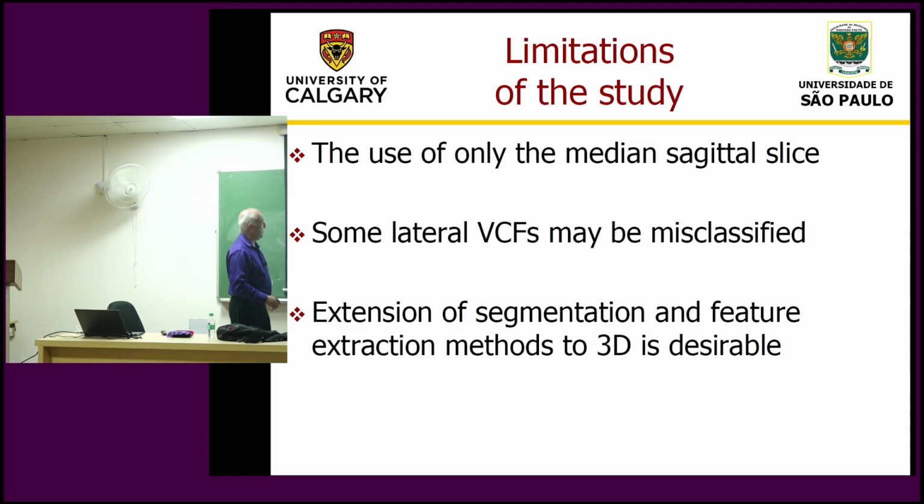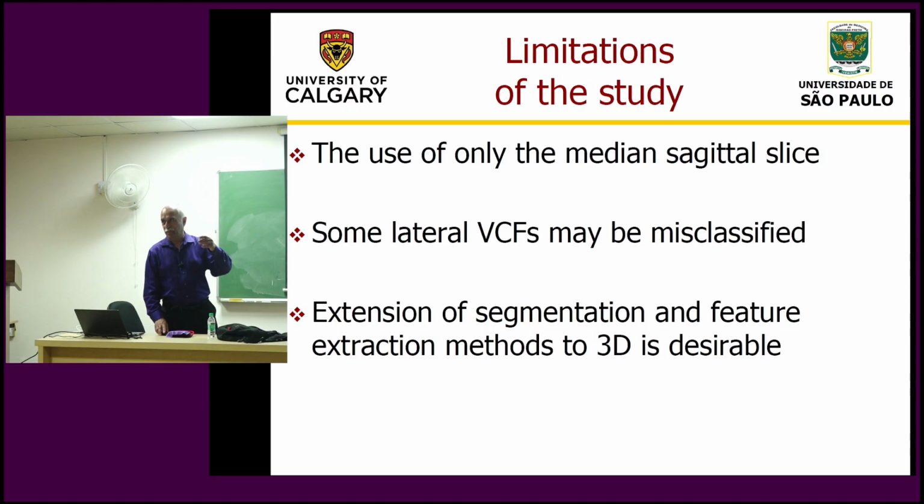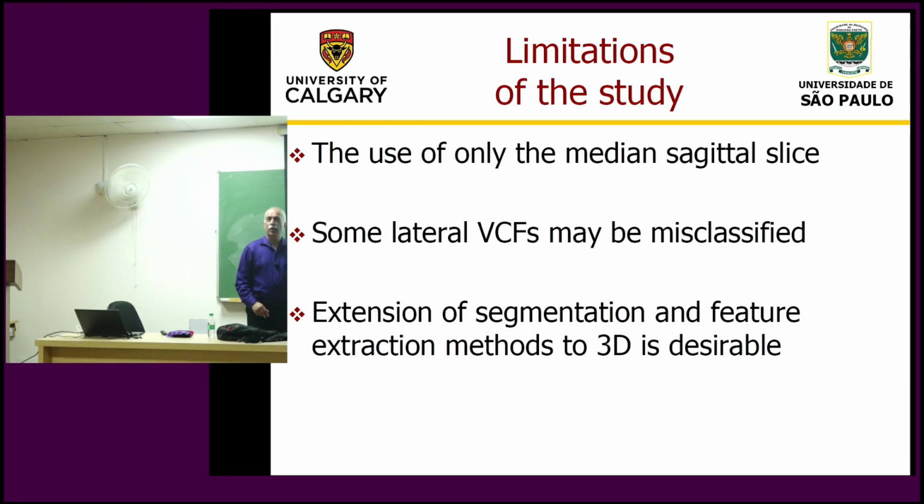Extension of segmentation and feature extraction to 3D is desirable, we said. That was also done by one of our collaborators, Paola Casti in Italy, as I said. She did this, and I was told, I was not involved in that project, there was not any substantial improvement in the results. There are other complications that arise when you go to 3D. The radiologist hasn't seen these things in 3D.